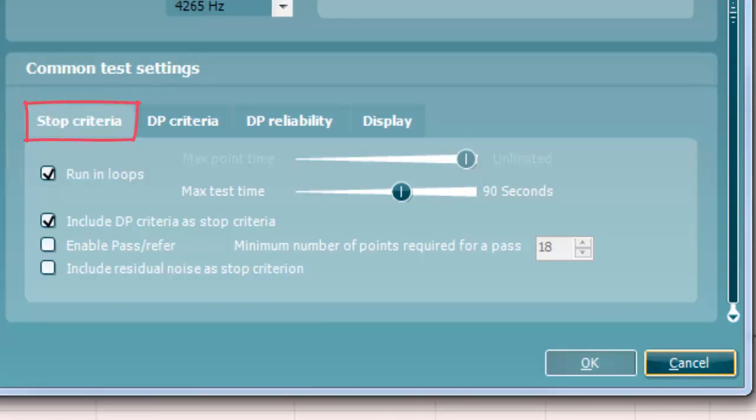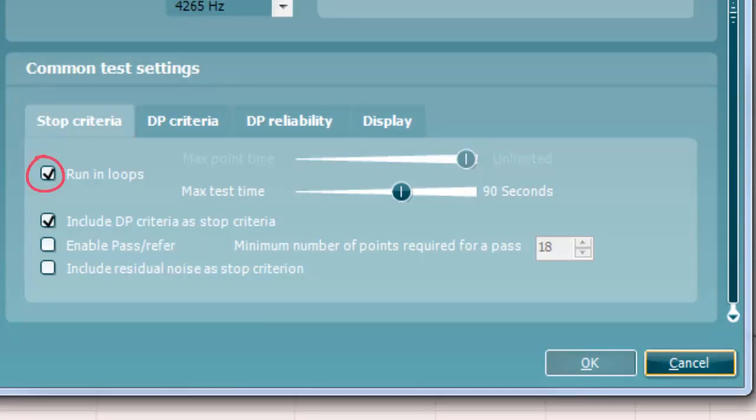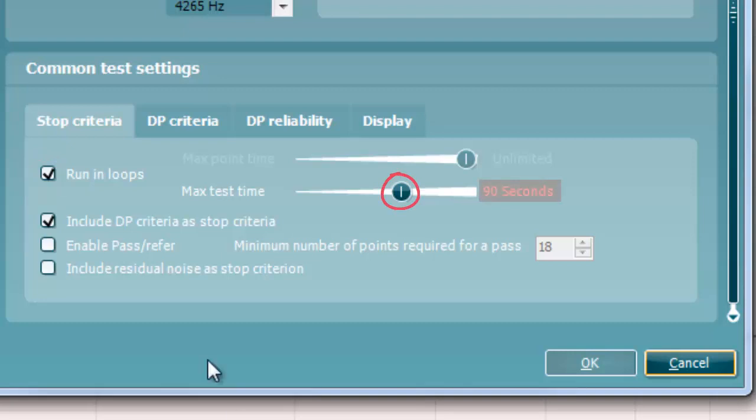Let's firstly look at stop criteria. The stop criteria tab allows you to specify when the measurement stops. When running loops is selected, the Maximum Test Time option is available. Here you can define how long the total DP gram test may take until it stops automatically by using the slider.